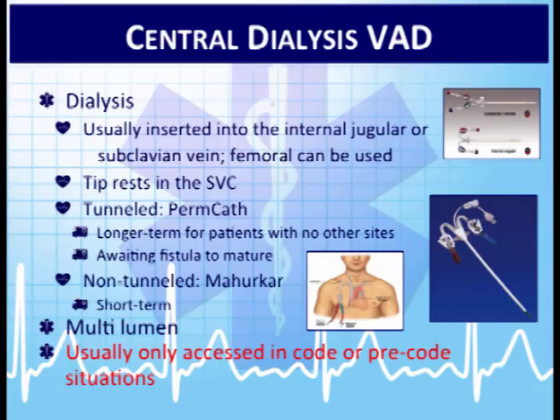I always think of it as the patient's lifeline. Even in the hospital, they do not touch the dialysis catheter. Many times they have to call their nephrologist to get permission to access a dialysis catheter. I know in Waukesha County, we have a guideline that we would follow in a code or pre-code situation if we can't get any other access. However, I would look back to what your medical directors and your guidelines say on the use of the dialysis catheters.